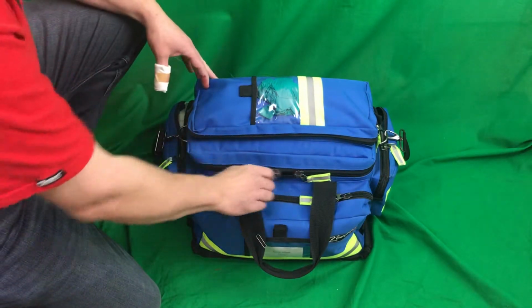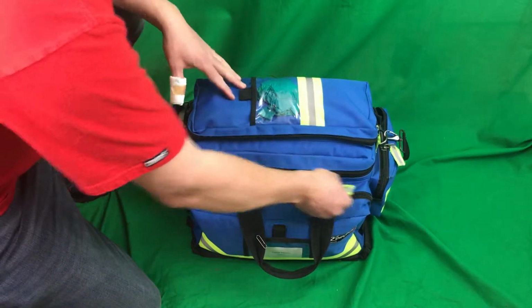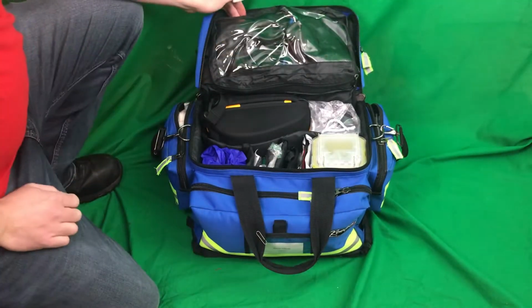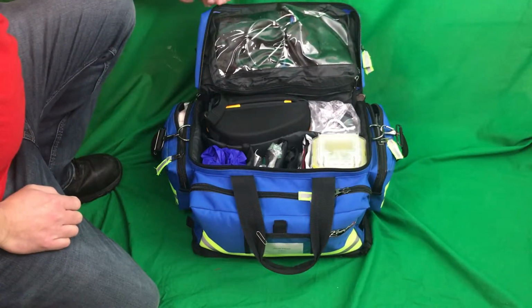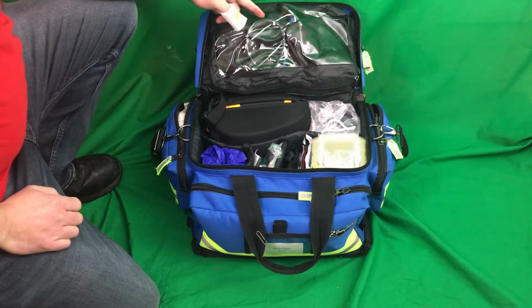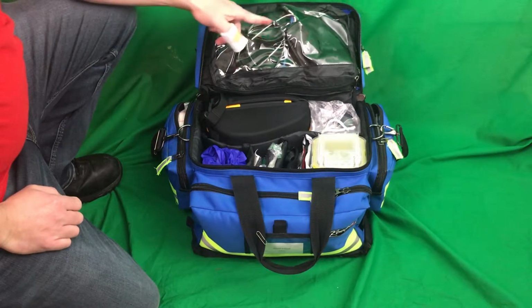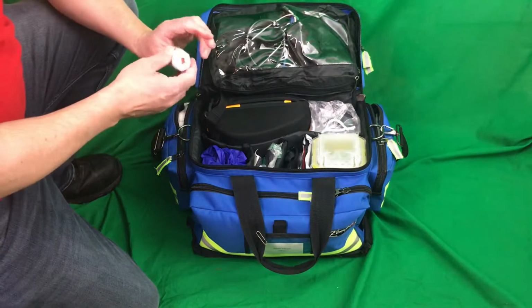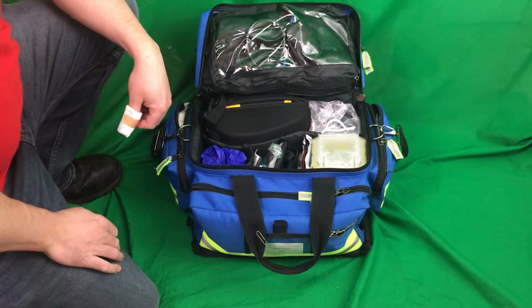So when you get into the bag, I open up the main compartment. Right on the top, I have my vital signs. I have a BGL monitor to check the sugar, an SpO2 meter, some pen and paper, a stethoscope, and a blood pressure cuff, and that old one. And yeah, I did cut myself a while ago, and I had to use my bag just a while ago.